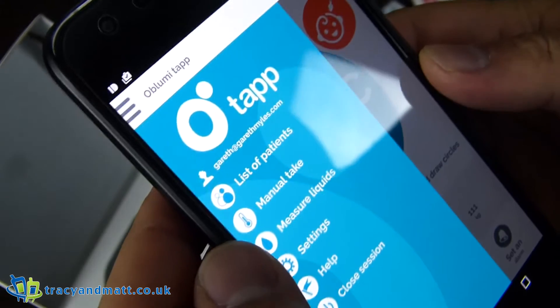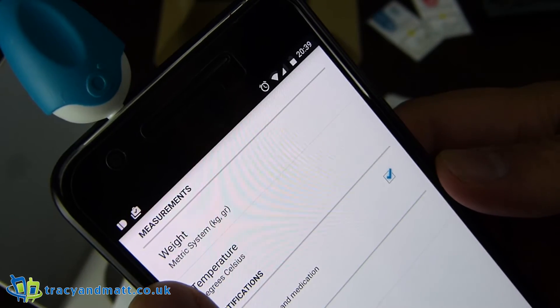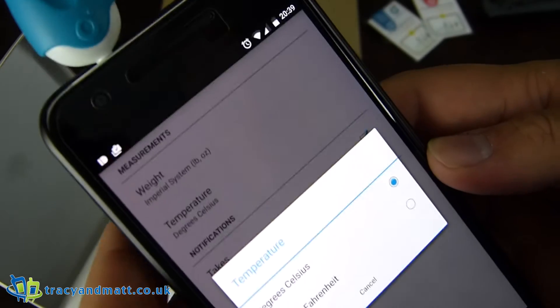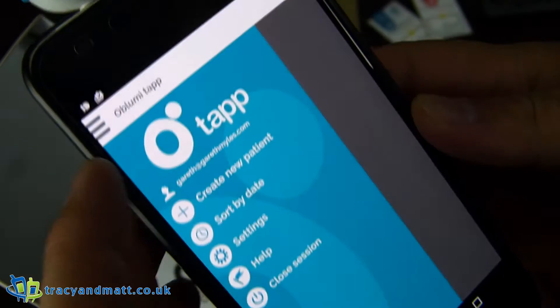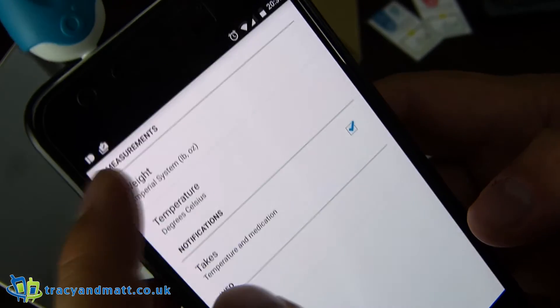So we'll go deep into the menu system here. We have the list of patients — we have me. We can sort them by name or date. Settings — weight. That's better because I have no idea what I am in kilograms; I know what I am in pounds and ounces. Temperature — degrees Celsius or Fahrenheit. It takes temperature and medication. It didn't convert me there even though I just changed over from kilograms to pounds and ounces.